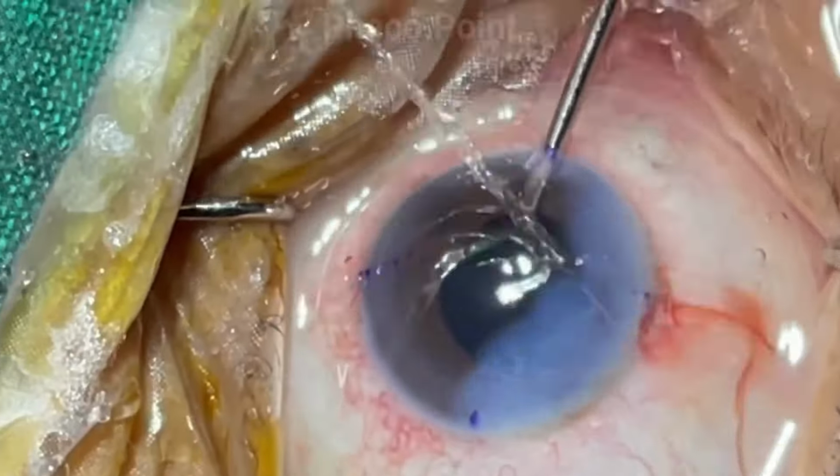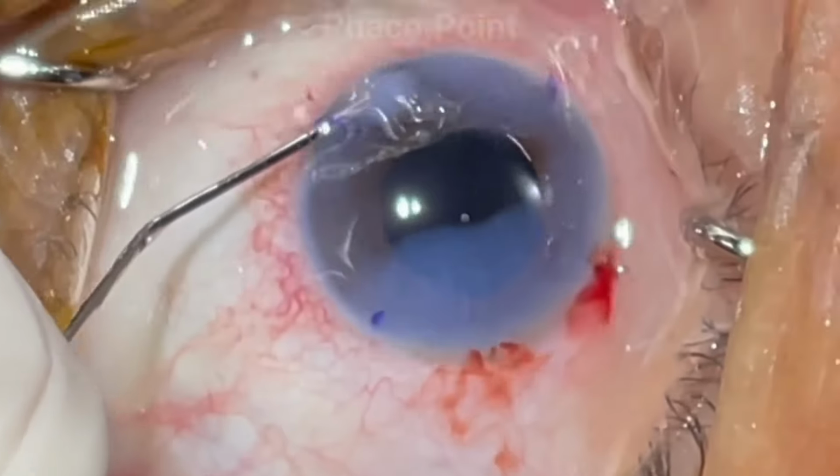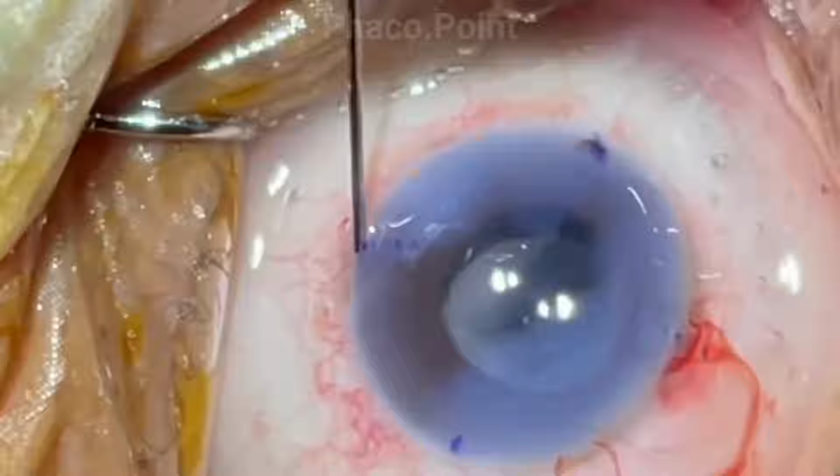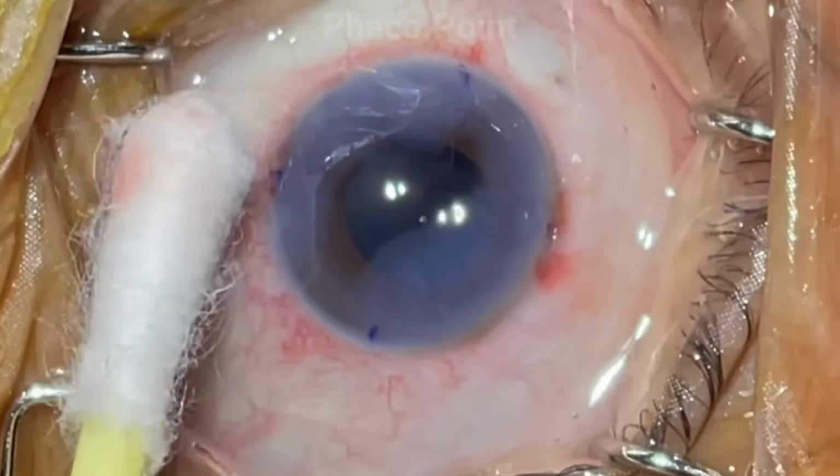The left side port being hydrated. The source of the irrigation is out now. The right side port is now hydrated. And finally, we move to hydrating the incision that was created 180 degrees opposite the main incision. We conclude by ensuring that the main incision, the side port incisions, and the incision that was made diametrically opposite the main incision are well sealed.